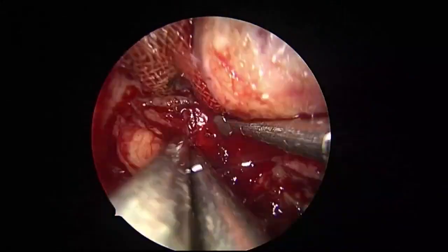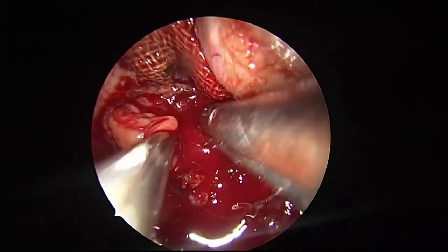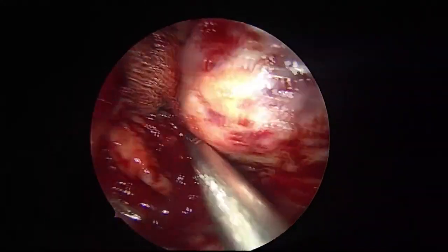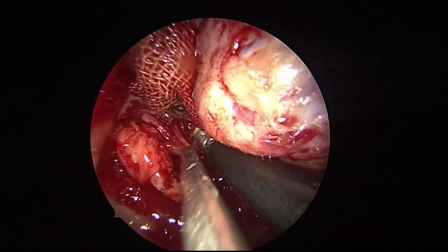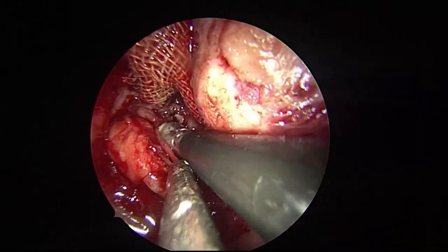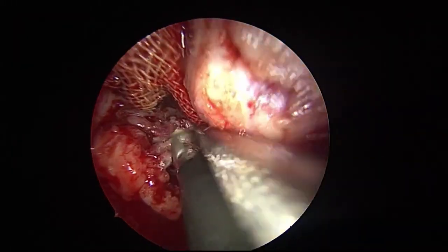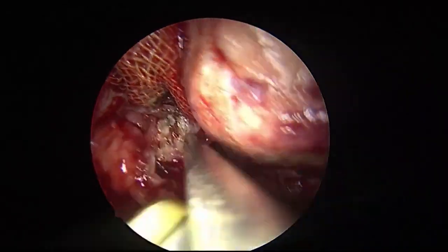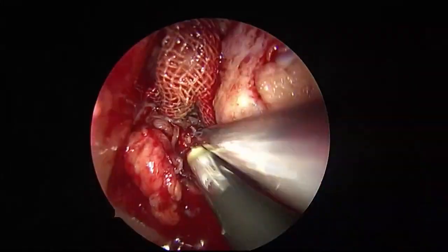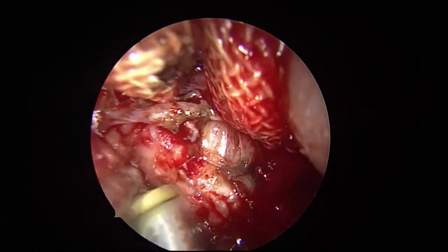I am more and more staying on the tumor. Coblator. Will show you acquiring more and more space. Yes. The surface is best visualized with the coblator.